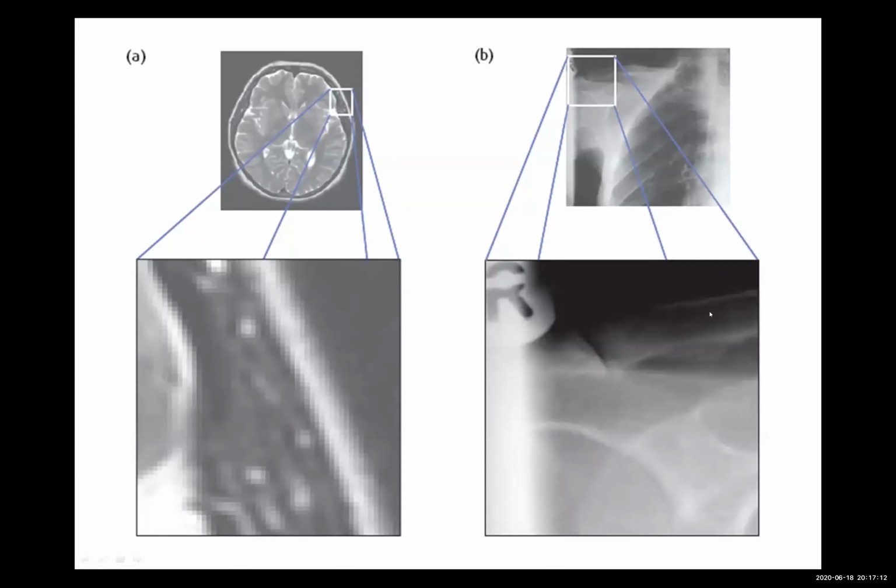For an X-ray, a conventional X-ray, there is no limit for the resolution. I'm not talking about digital X-ray, I'm talking about conventional X-ray, the plain film that we used in old ages. If you take an X-ray film and project it on a stadium screen, it will not show any pixels, because there are no pixels. It is conventional, not digital. While with MRI, because it's digital, there is a limitation to your resolution, besides time. If we zoom in, we will get to the point where that is the maximum, and you will start to see those pixels.